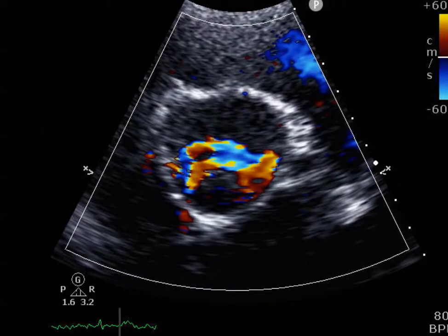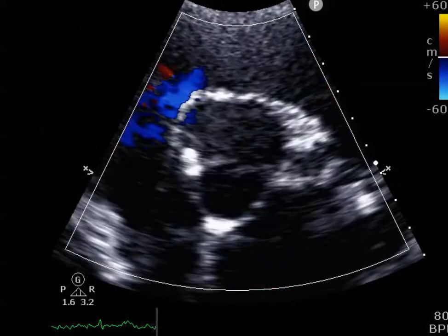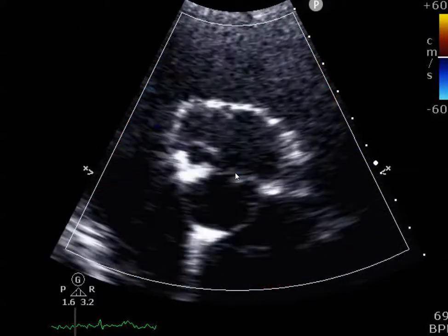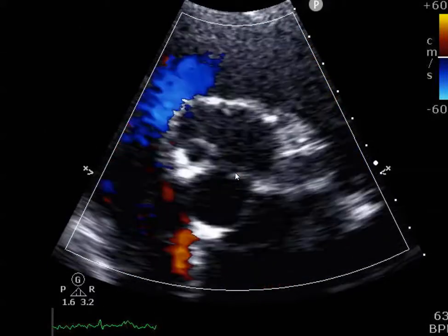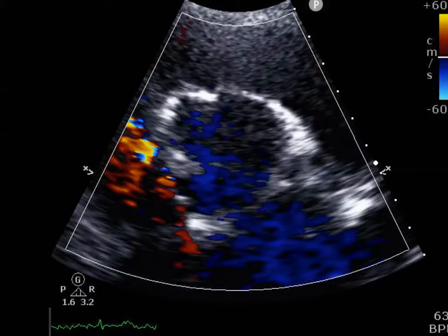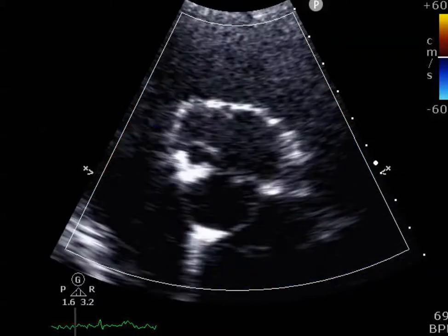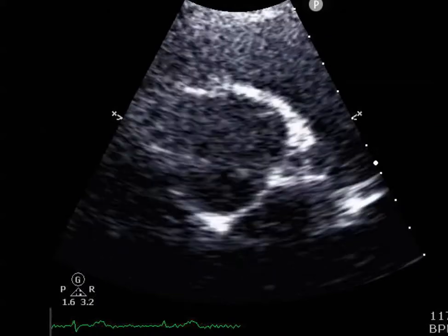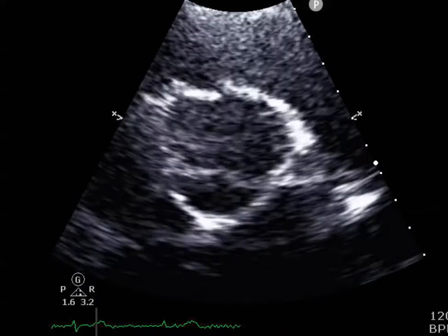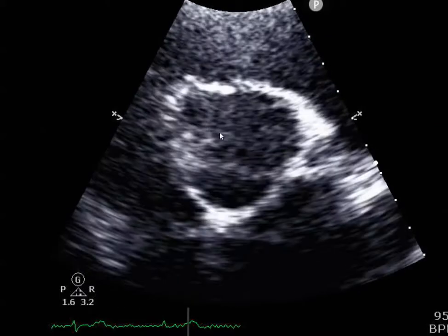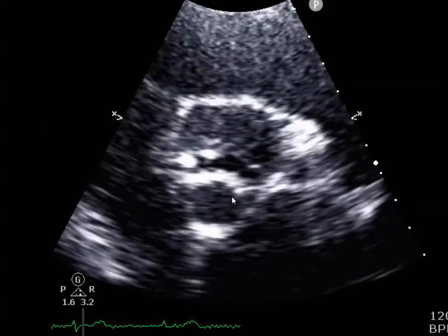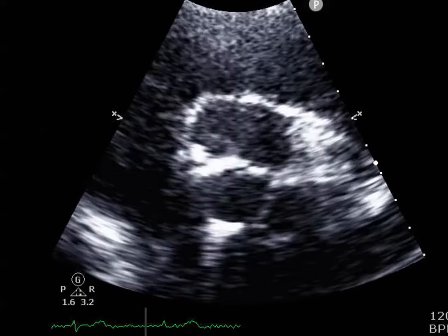Here it is on short axis view. There's some turbulence here which tells you there's a fair amount of aortic stenosis as well. On short axis view without color, it looks like the right and left cusps are fused.